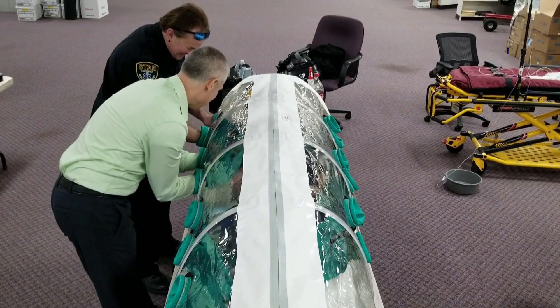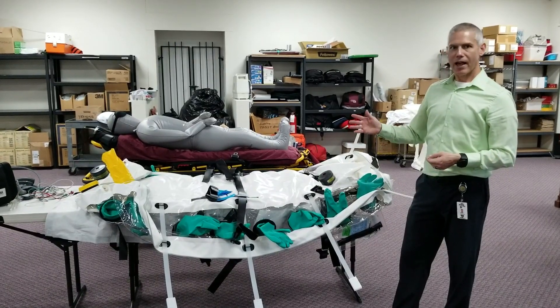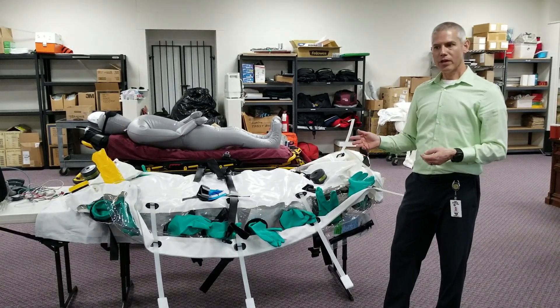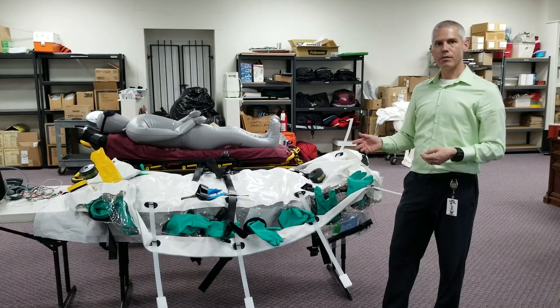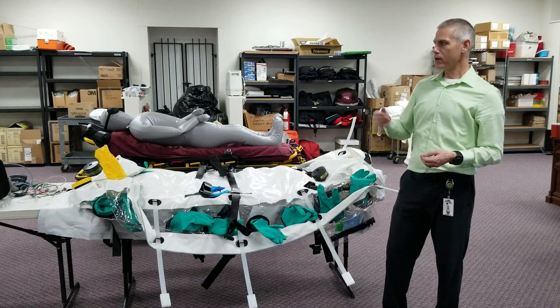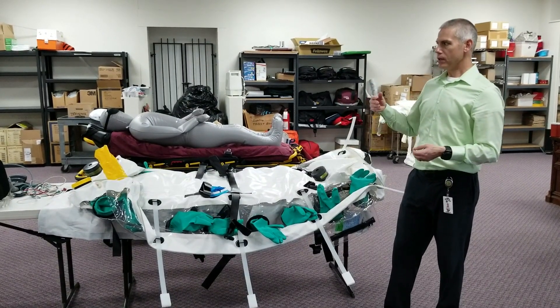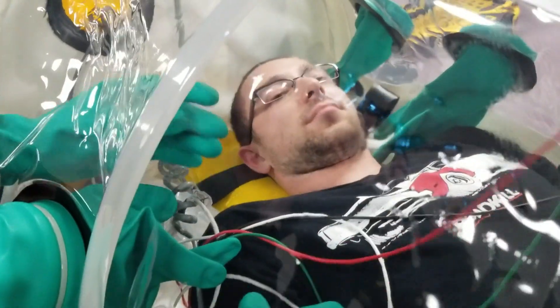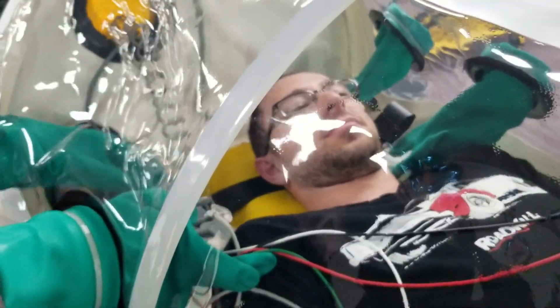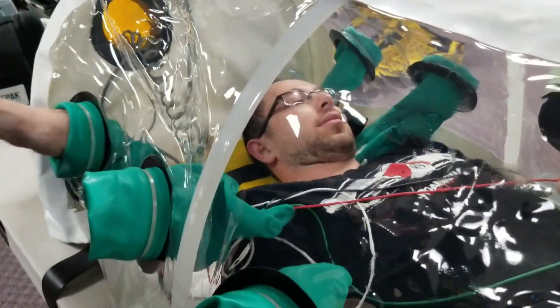The isopod also has access ports so that once the patient is inside, we can safely give the patient food, water, and other comfort care. We have a snorkel port where we can feed in oxygen, and all of our heart monitoring, blood pressure, and pulse oximetry devices can fit through there and be decontaminated later and reused.